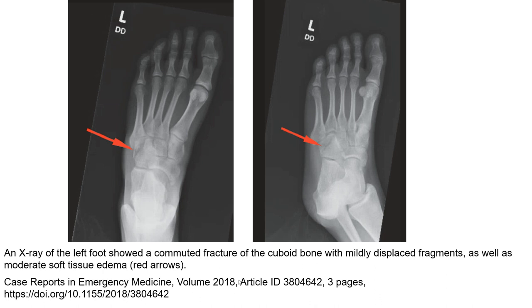In this case, the x-ray demonstrates a comminuted fracture of the cuboid bone with a mildly displaced fragment, as well as moderate soft tissue edema.